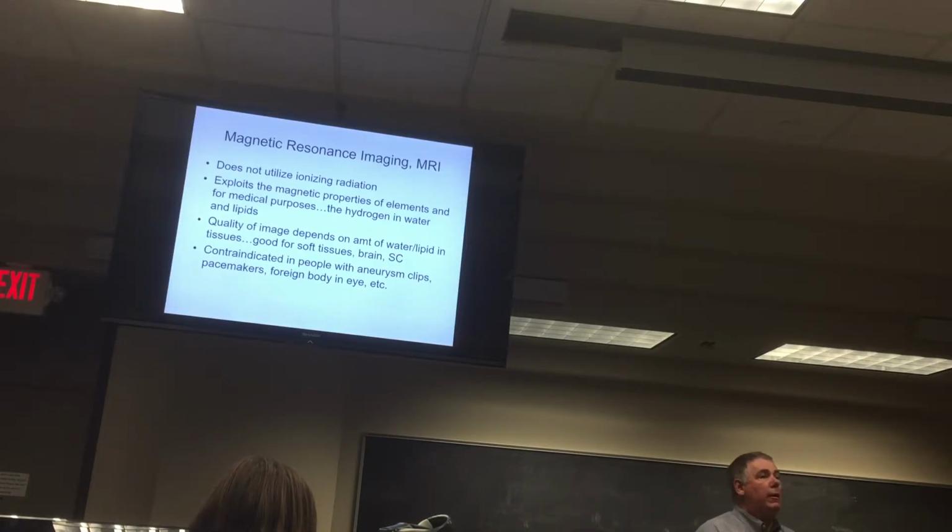Okay? You just have to make sure that, and for gosh sakes, take your phone, take all of the electronics, and leave it outside the room, or when you get on them at the end of the thing, they'll be completely blank. So it's a pretty strong magnet.